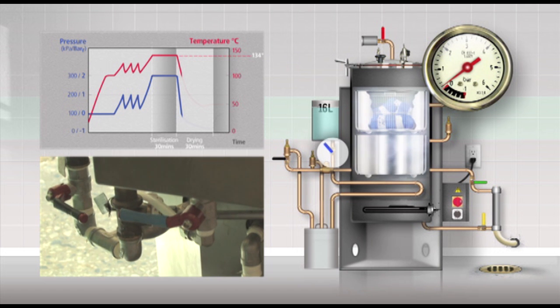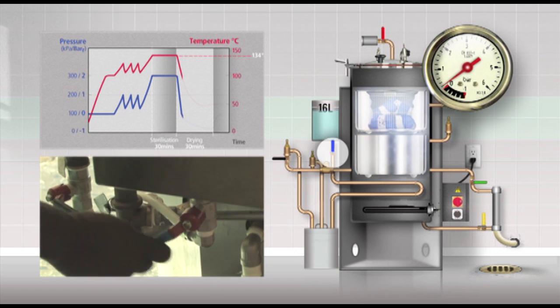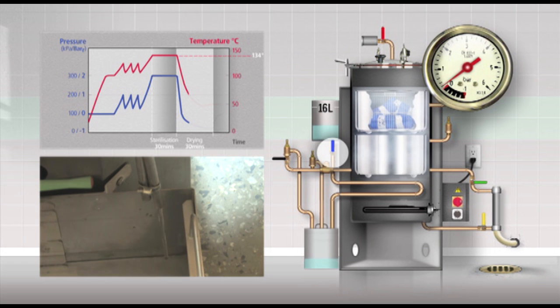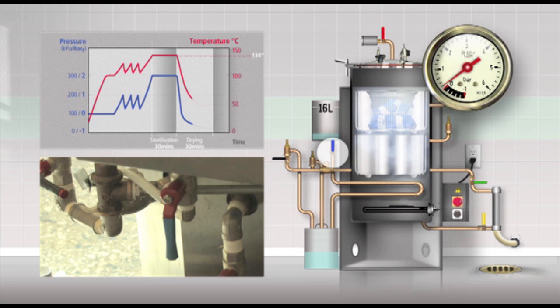Now open the blue valve. This is the cold water supply to the cooling coil. The cooling water passes through the cooling coil and will collect in the lower water tank.